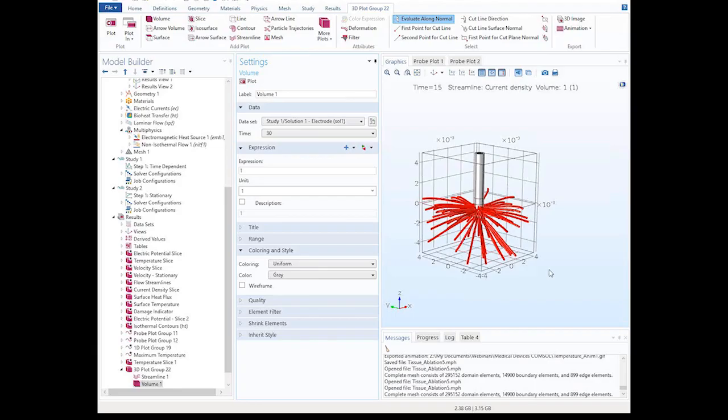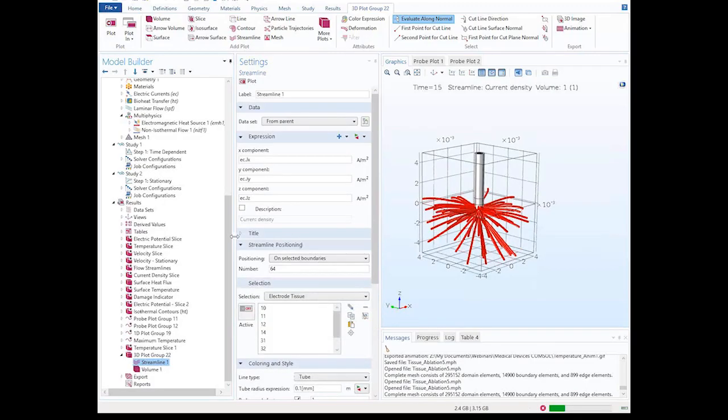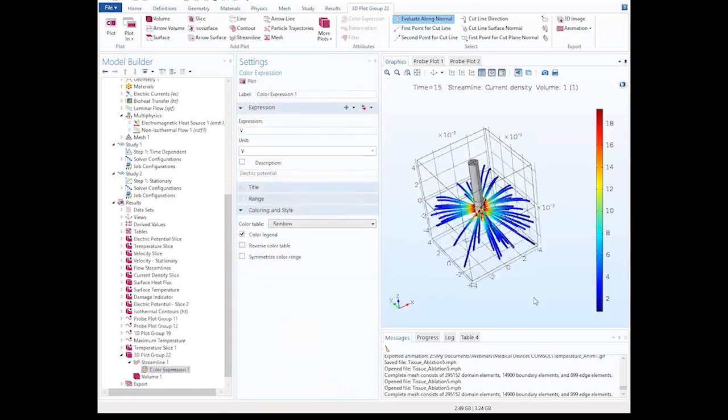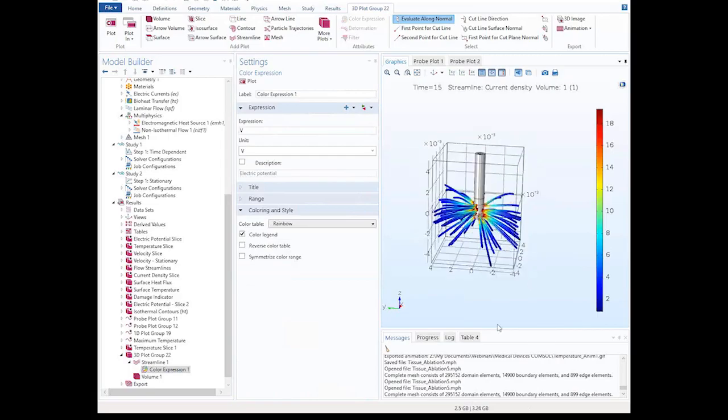And you see how easy it is. And for example, the streamlines are red now. Let's say I don't want it to be red. I want the color to be more useful. So here they are now, proportional in magnitude to the velocity, to the voltage. You can make anything else, but as you can see, it was relatively quite straightforward to generate that.